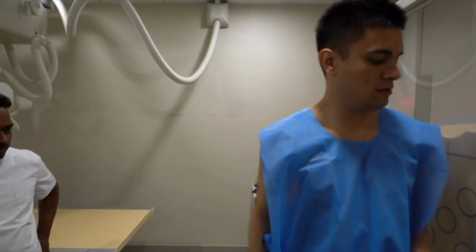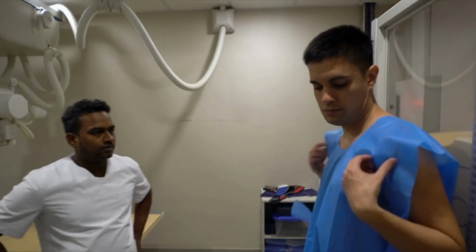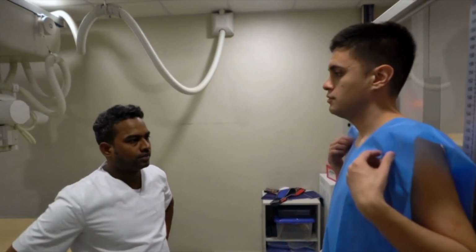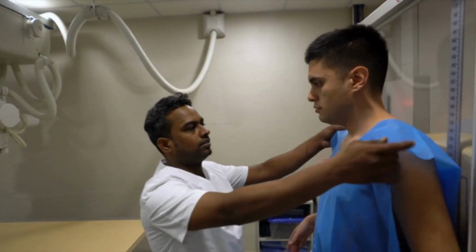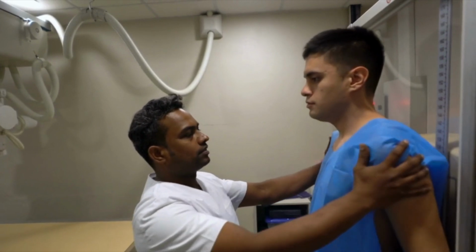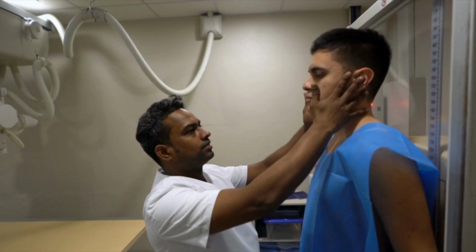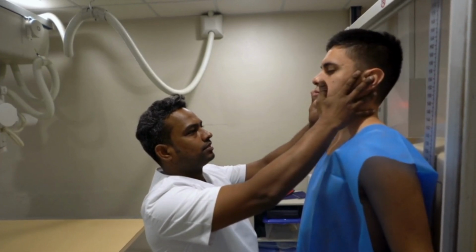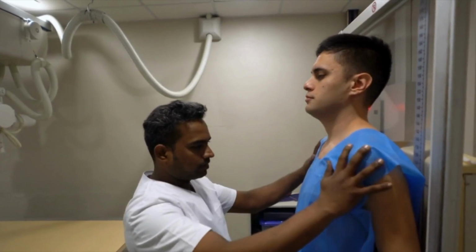There are multiple benefits of X-ray imaging. One, they're quick and efficient. X-ray exams typically take only a few moments to perform. Therefore, they can provide near immediate results, assuming that you have someone that's able to interpret them, of course. They are, again, non-invasive, painless. They do not require any type of surgical intervention, and they are widely available. So they are common in hospitals and clinics, making imaging accessible for various conditions at a variety of facility types.